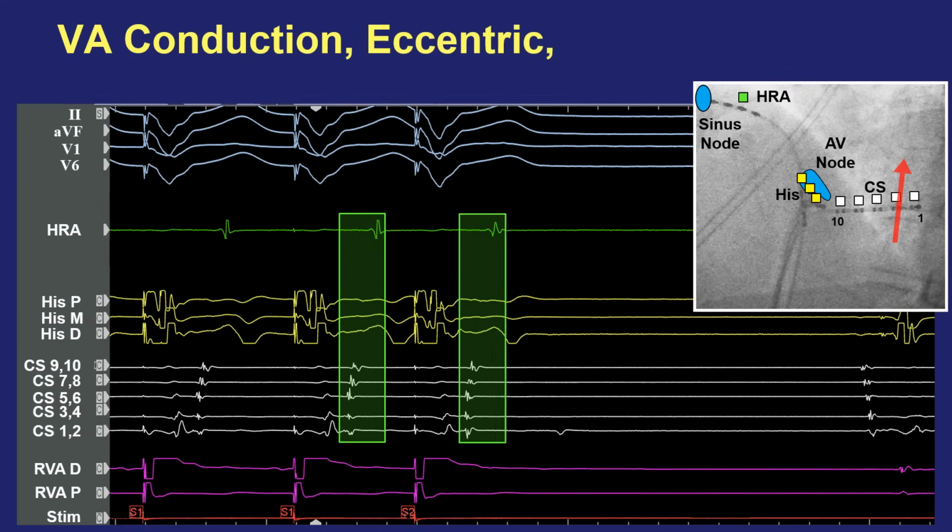In fact, again, probably far enough away from the septum and far enough away from where the anatomic location of the AV node is. So I can tell you, even without looking whether there's decrement or not, that this is almost certainly accessory pathway conduction, just not where the AV node is located.